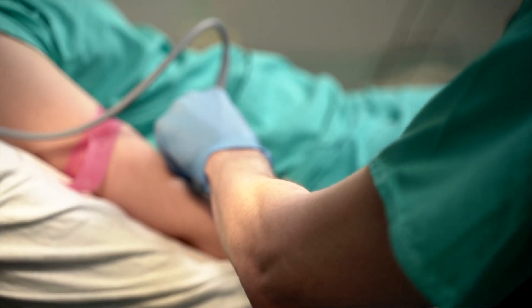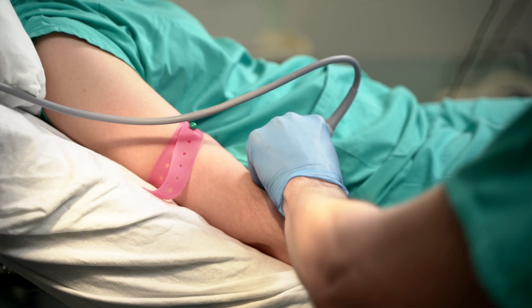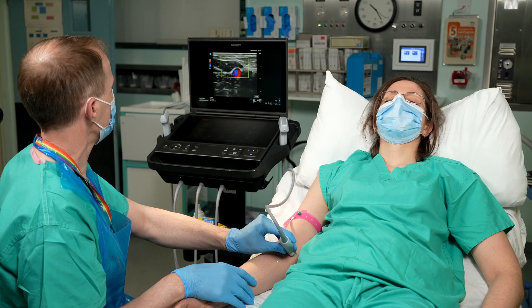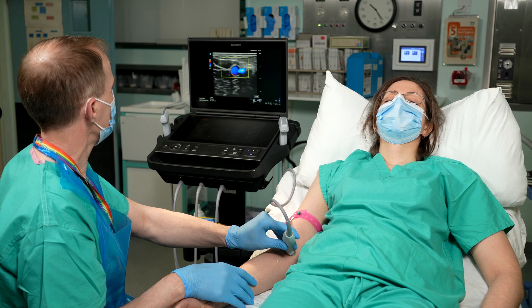You want to find a vein that looks relatively large and straight on the screen, and not too deep, otherwise it'll be too difficult to get into. Try to choose a vein that sits on a nice straight part of the arm, as vessels overlying elbows and wrists will probably move and kink, making your line more likely to tissue or come out. Hands, wrists, and elbows are all mobile body parts, and cannulas placed in these areas tend to have a shorter lifespan than cannulas on straight parts of the arm.